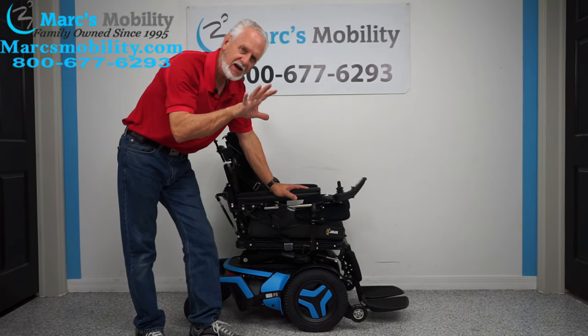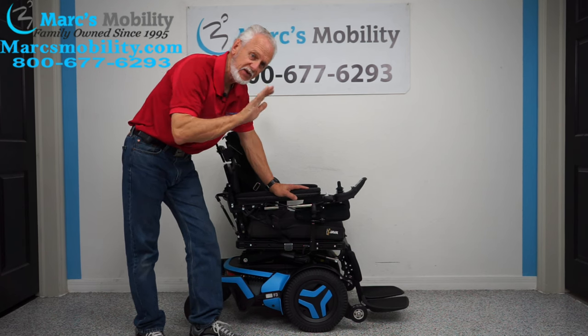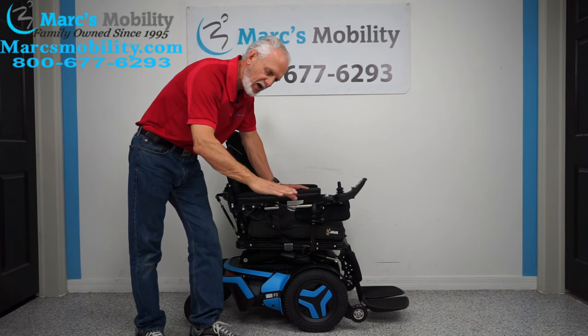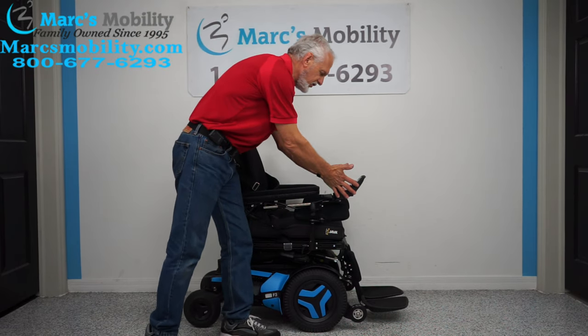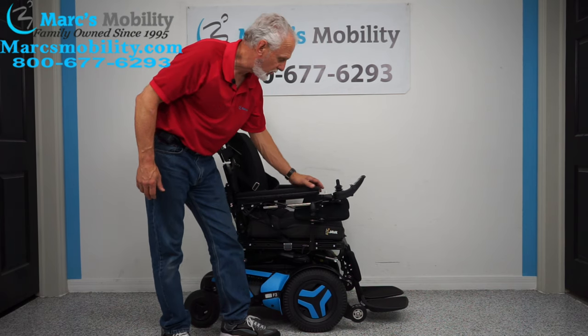This chair has five electrical functions. It has the 12-inch seat lift, the electric tilt, the electric recline, the electric leg, and it also has an anterior tilt where it tilts forward. If you want to use any of the functions, you can do it through the joystick or through the switch box. I like to use the switch box — it's a little quicker for me.